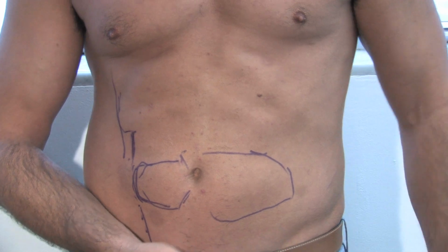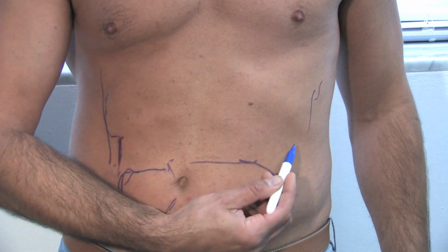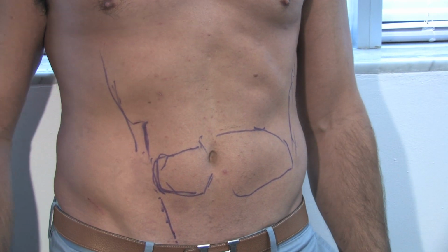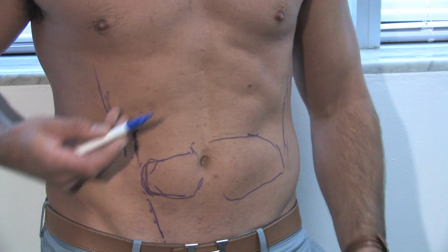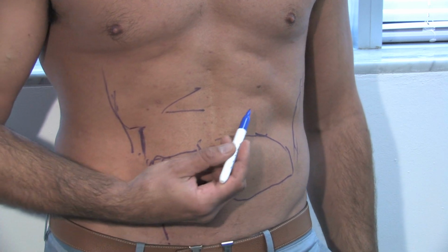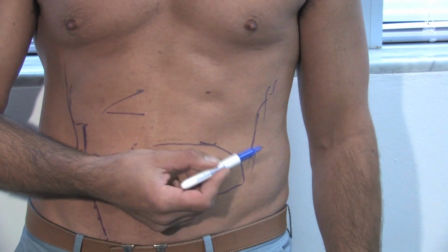And if we go over here, where's the edge? It's kind of just this ill-defined blob. You can kind of see an edge out here. So you consider that, that's a big change. You do see some shadow here, but there's no sharp line. We have sharp linear definition here. And look at this guy. This guy is just like a solid line there. There you get the hint of it, but it's kind of lost. And then we lose these shadows and cellulite over here.